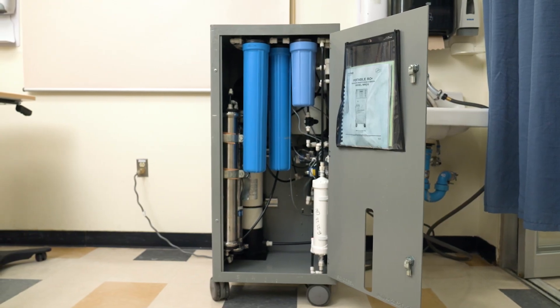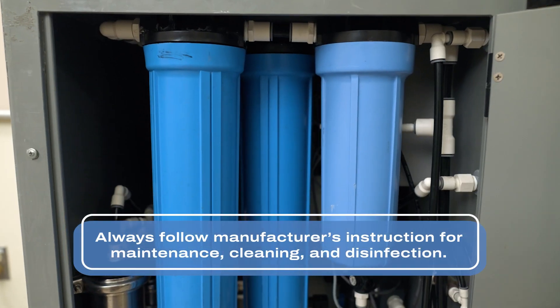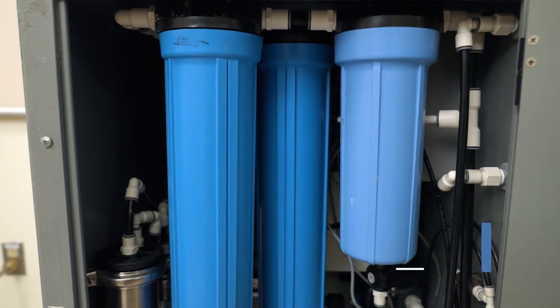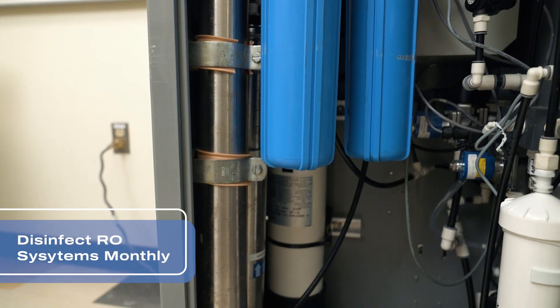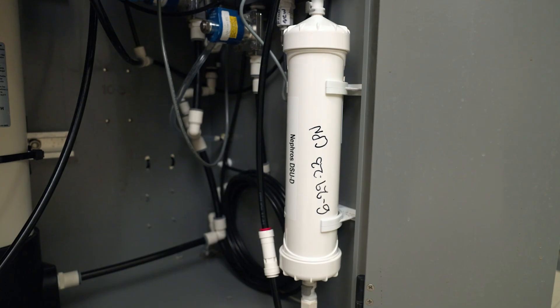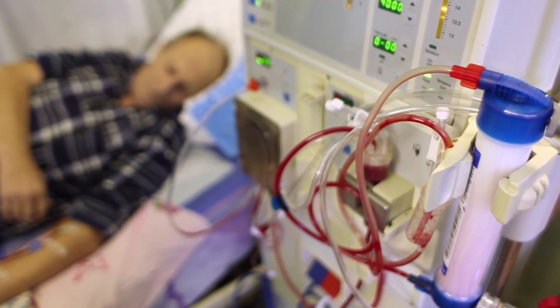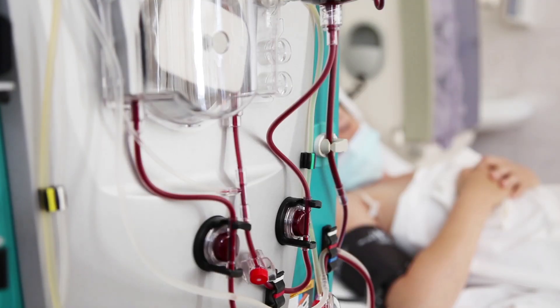In addition to proper testing, it's also important to regularly disinfect the portable RO machines. The water distribution loops, main RO, and portable ROs should be disinfected on a monthly basis. Additionally, the inlet line on dialysis machines and portable ROs should also be disinfected on a monthly basis. Carbon filters must be maintained and changed per manufacturer's recommendation. For the safety of your hemodialysis patients, it's imperative that water samples are collected in both a proper and timely fashion to ensure that the treatment water maintains safe and healthy levels.